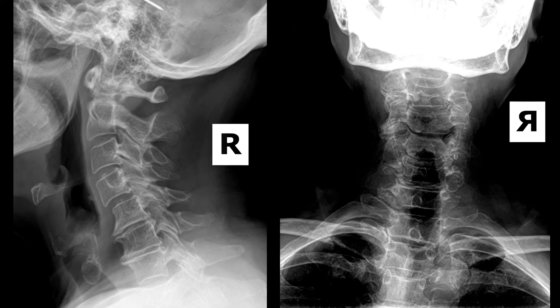Lastly, since you've seen a lot of examples of lateral cervical views, here's what it looks like on a frontal cervical view. If all you had was a frontal view, good luck — it's very challenging to see these cyst-like calcifications on the frontal view. They're typically not midline, usually going to be off to the left or right. On the lateral view you can see it very easily, inferior to the thyroid and laryngeal cartilage. This is a good example of a thyroid cyst that again needs follow-up.